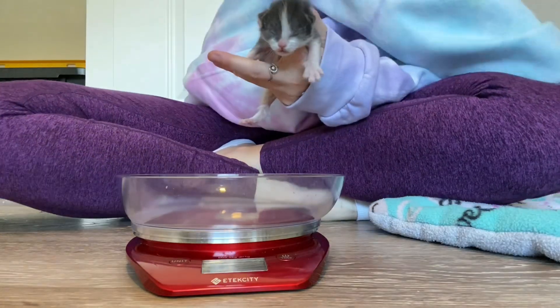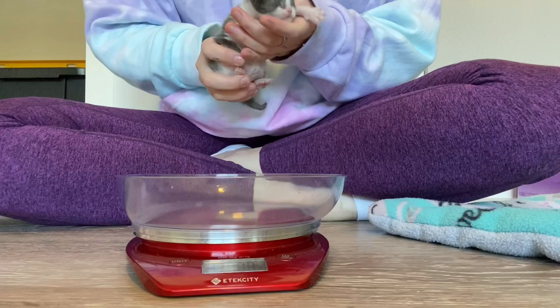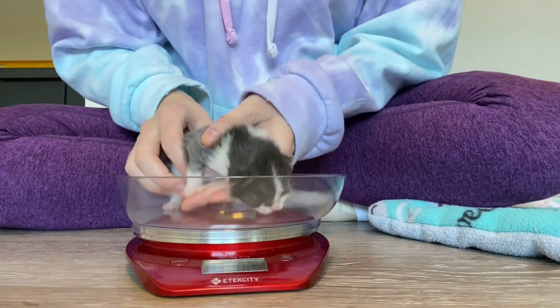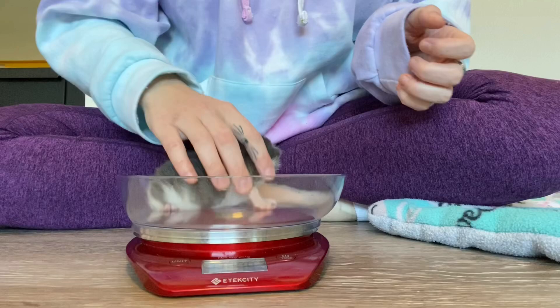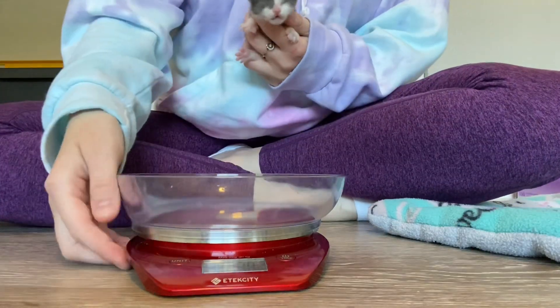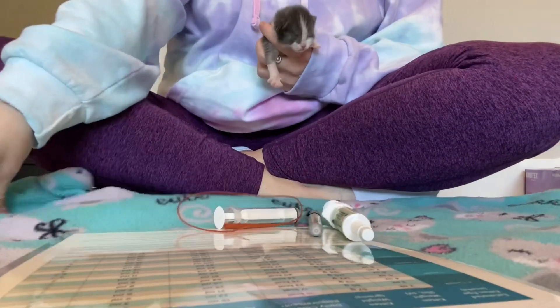Here I've got Mouse and the first thing we want to do is weigh our kitten. I am doing so in grams because he is only a couple weeks old, but if you have an older kitten, you can also do it in ounces. Once you get that weight, you're going to look at your stomach capacity chart to see how much your kitten needs to be fed.